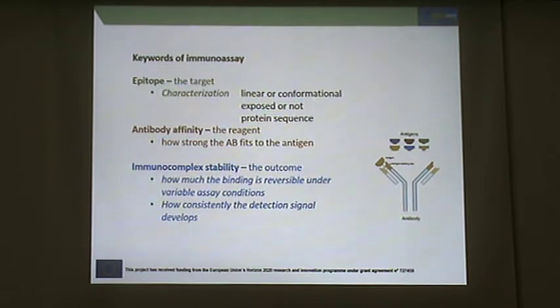And when we talk about the outcome of the assay, we refer to the immunocomplex, and particularly immunocomplex stability gives us the quality of the analytical system.